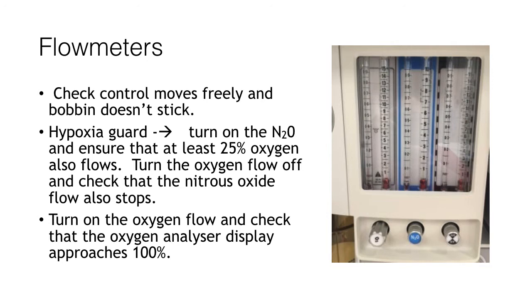At this point you should also check the hypoxia guard. This is where you turn on nitrous oxide and by visualising the flow meter you can see that at least 25% oxygen will also flow to prevent a hypoxic mixture being delivered to the patient. If you then subsequently turn the oxygen flow off, we should see that the nitrous oxide flow will also stop. We should also turn the oxygen flow to maximum and check that the oxygen analyser displays that it is approaching 100%, ensuring that this is correctly working.